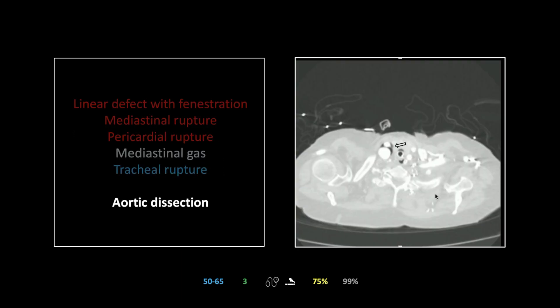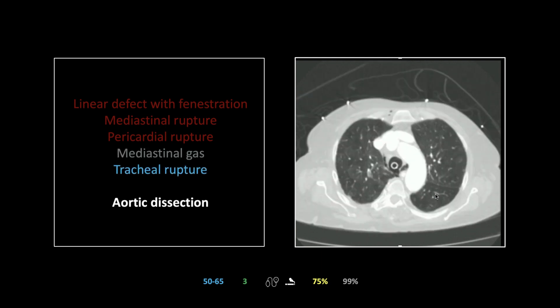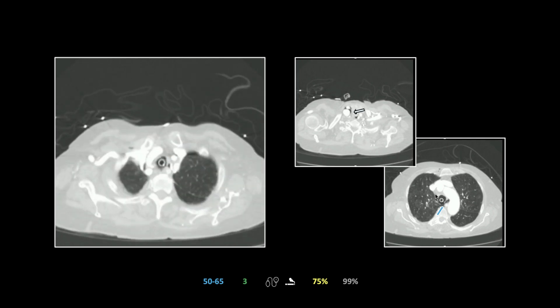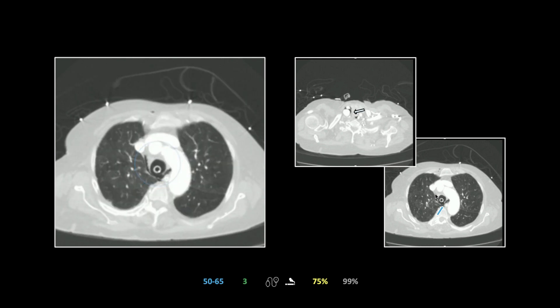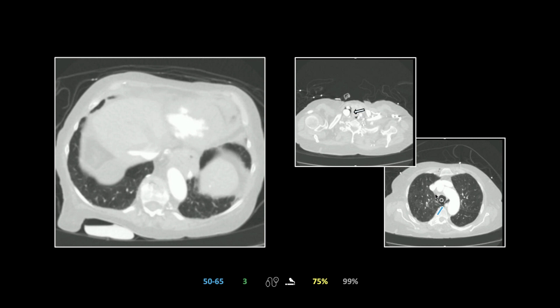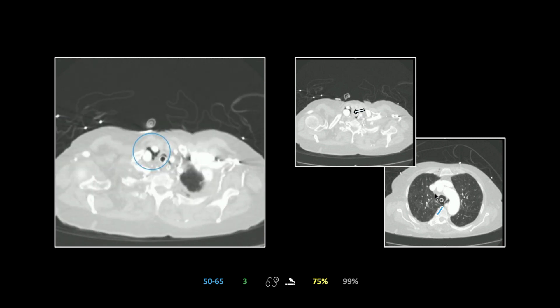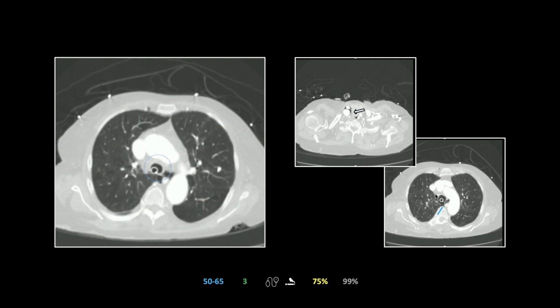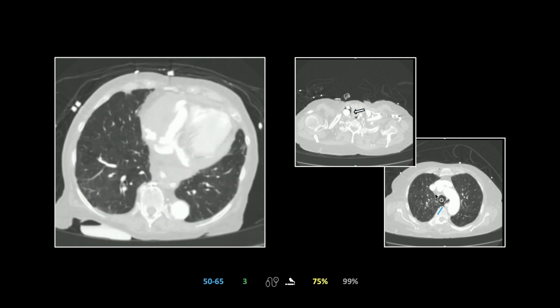This patient had additional findings: gas surrounding the supraclavicular vessels and down in the mediastinum, with a ruptured posterior tracheal membrane — a complication of either not pulling back the stylet from inside the tube or over-inflation of the balloon. The turgid appearance of the balloon suggests over-inflation is more likely, as most clinicians are trained to pull the stylet back automatically. This is a very unfortunate patient with hemopericardium and tracheal rupture.